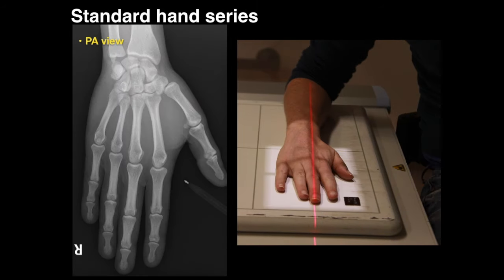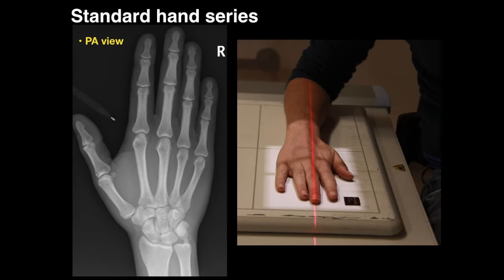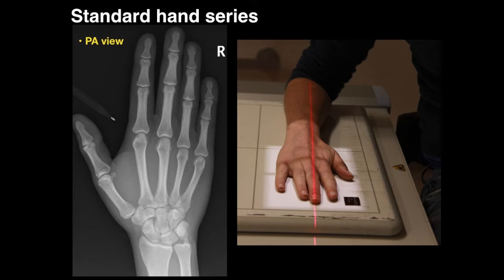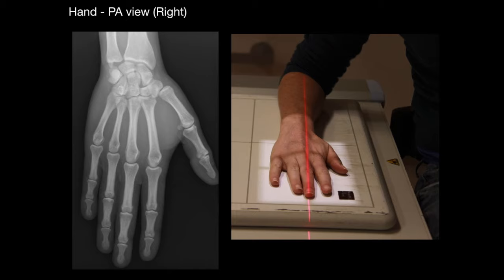The PA view is taken with the hand down, and we view the image as PA, oblique, and lateral. The PA view is good for demonstrating the carpals, metacarpals, phalanges, radius, and ulna in their anatomical position — really good for metacarpals. It's also good for evaluating whether a patient may have rheumatoid arthritis or osteoarthritis.